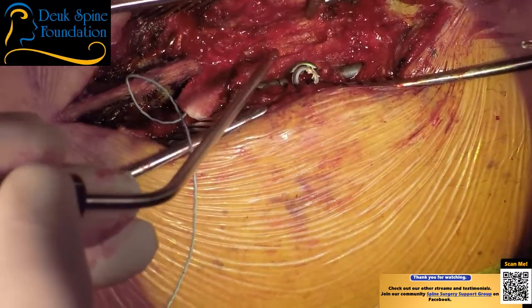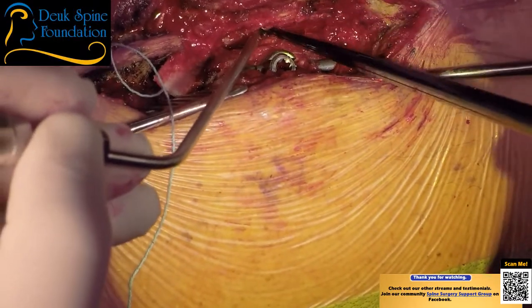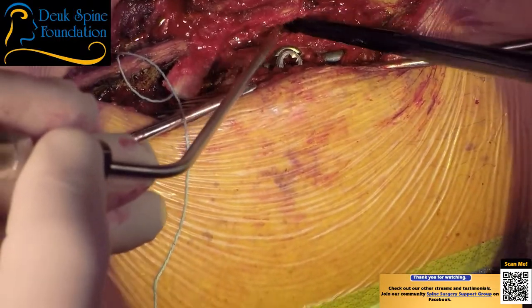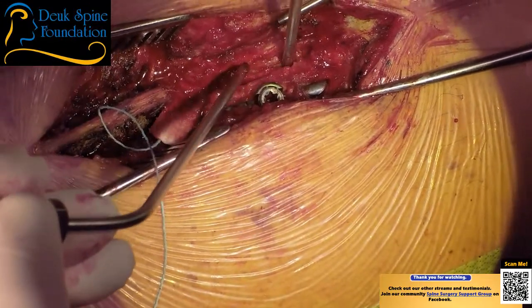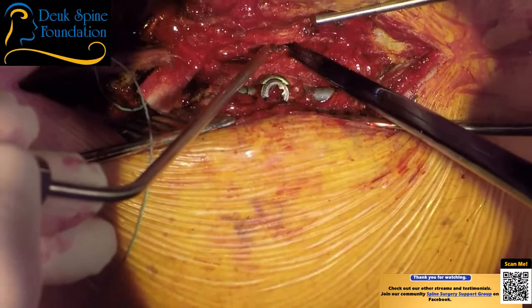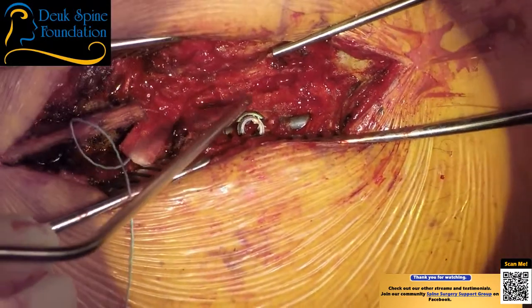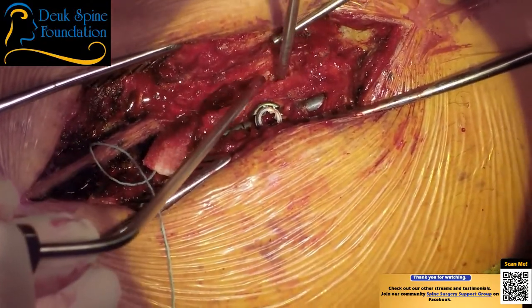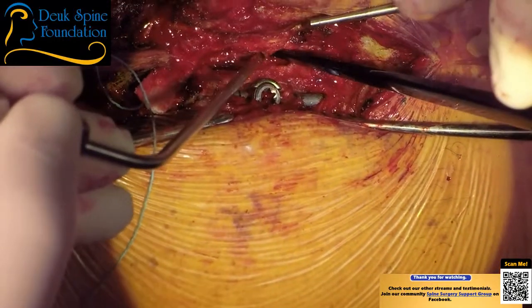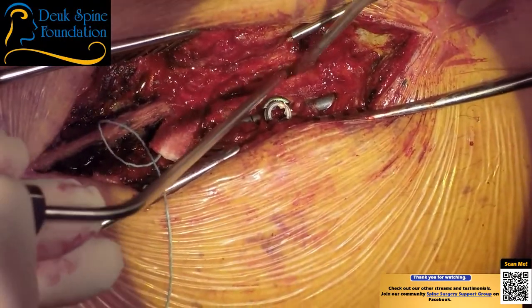Yeah. All right, this is it, folks. Ten more minutes of decompression, and then the arthrodesis part's easy. And then I'm starting to close. Okay. We're just about done. So, yeah, this is going really well. Thank you, Dr. Patel. Thank you, Louise.